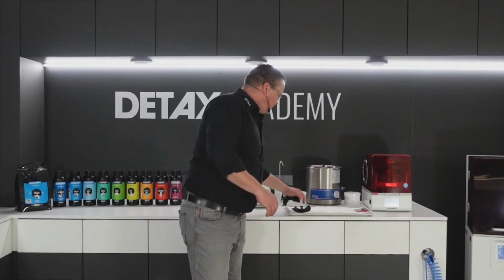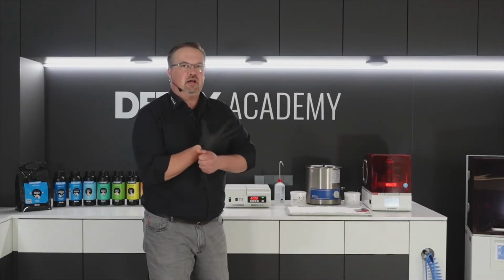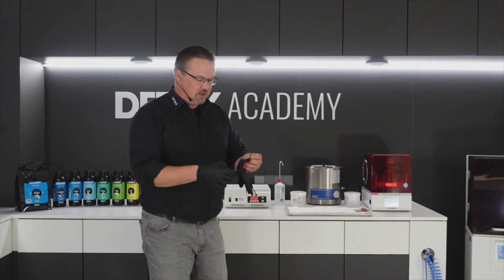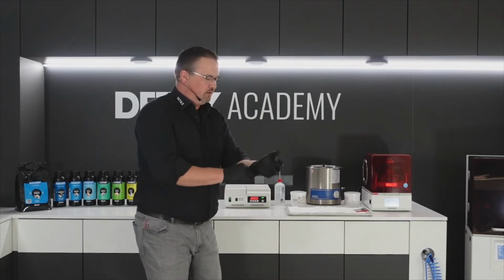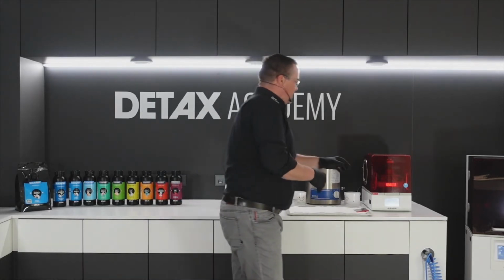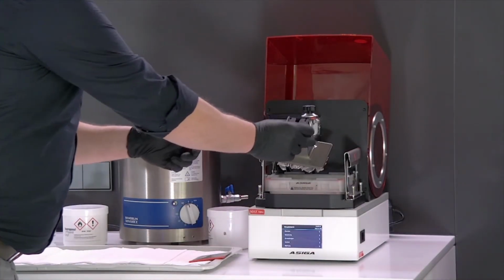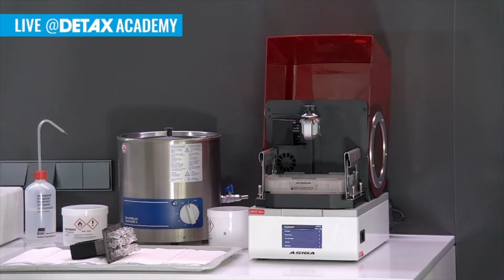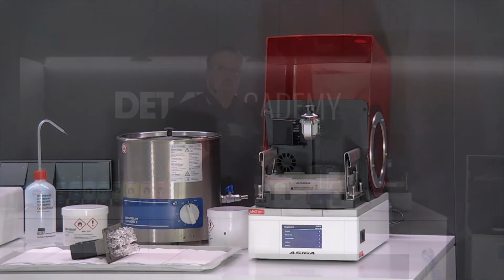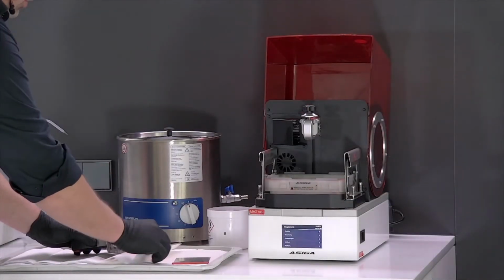So in the beginning, some minutes before we start the live webinar here, I started the printer that I can show you how easy it is to lose the objects from the platform. So that means we open the printer, take out the platform, take it here on our table, and I love to work with a regular spatula. It's a Japanese spatula. It is more flexible than the other and also thinner.